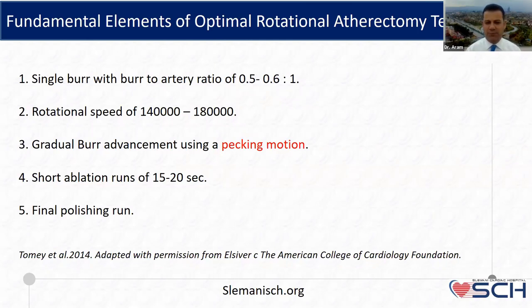One of the important points, the most important point in doing rotablation, is to have a pecking motion. By pecking motion, we mean, in Arabic, nakhr. It should be a movement like that. You shouldn't go back and forth monotonically. No, you should have a pecking motion. This is very important because with the pecking motion, you are avoiding one of the most disastrous complications, which is the burr getting stuck.